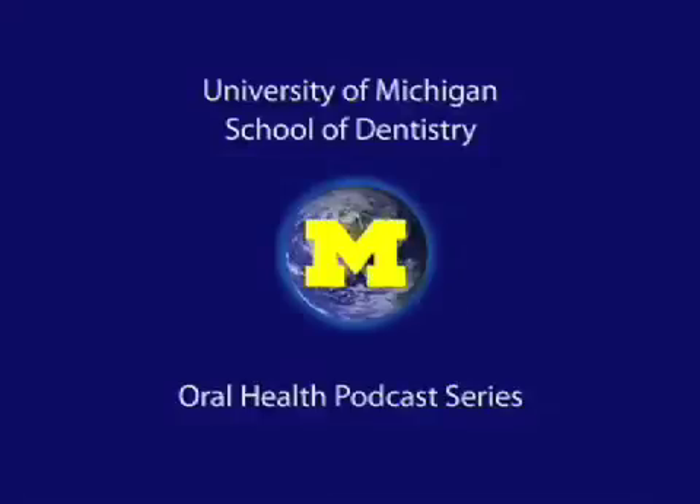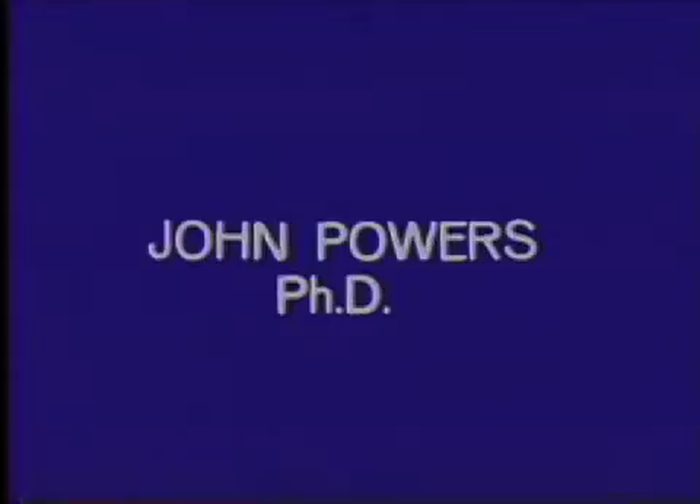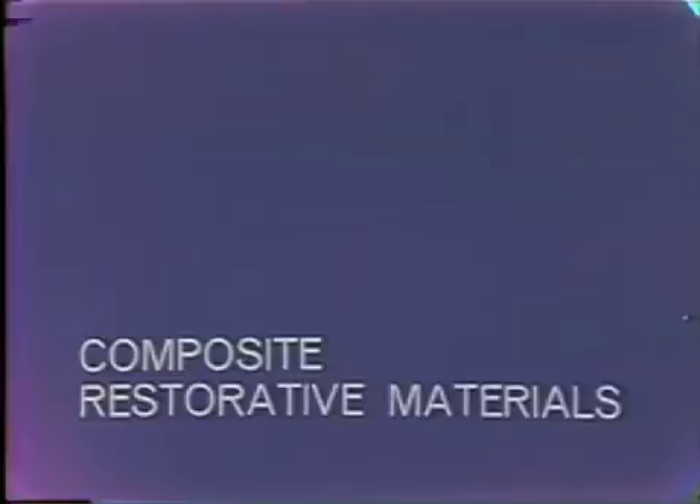Welcome to the University of Michigan Dentistry Podcast Series, promoting oral health care worldwide. I will demonstrate the mixing of two composite restorative materials: a paste-liquid system and a two-paste system.